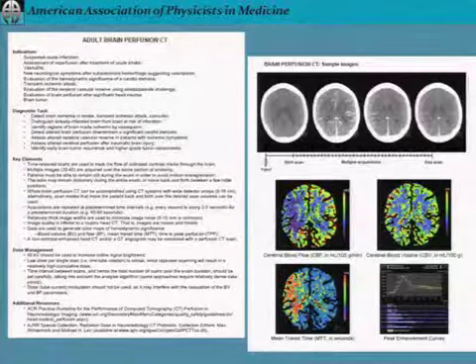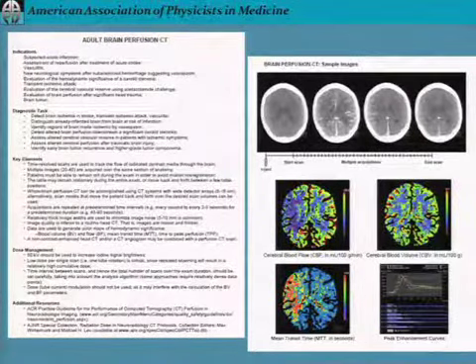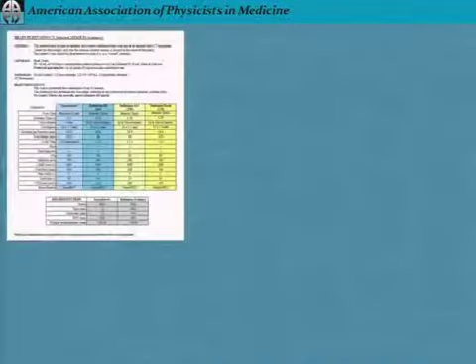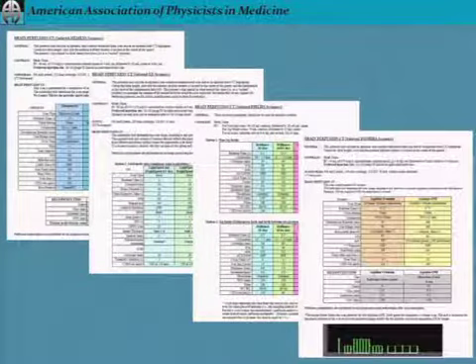We sort of give some indications, some diagnostic task elements, and a bunch of general knowledge about what the particular exam is intended to do, some example images, and then every vendor is allowed to put up, it's a little bit loose, but I think we're aiming at 4 scanner models per vendor. Some of them, we've gone a little more than that. Some of the vendors have chosen to use fewer, but every model uses the terminology that's actually on the scanner, so that it should be very easy to go in, look this over, compare it to your own scanner, and tell whether or not you're kind of in the right ballpark.